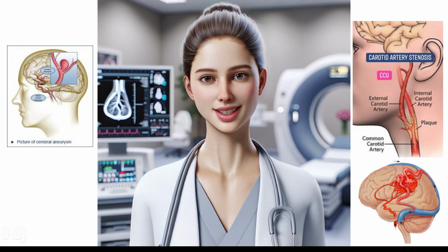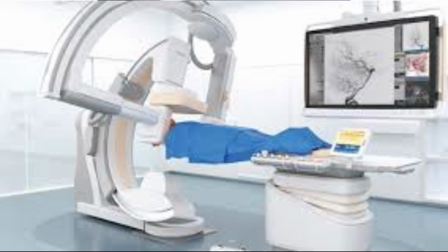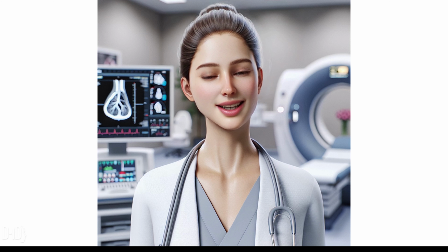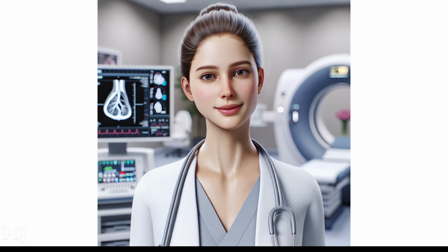Imaging. The physician may rotate the angiography equipment and capture images from different angles to obtain a comprehensive view of the brain's vasculature. This helps identify any potential blockages or anomalies in the arteries.